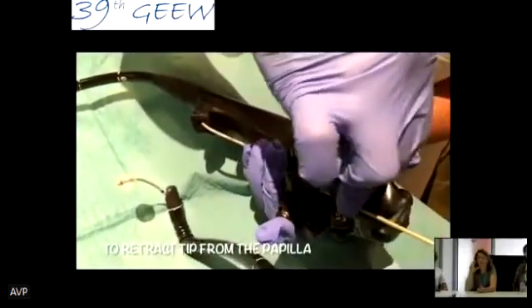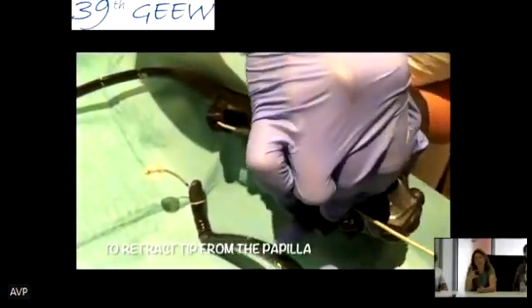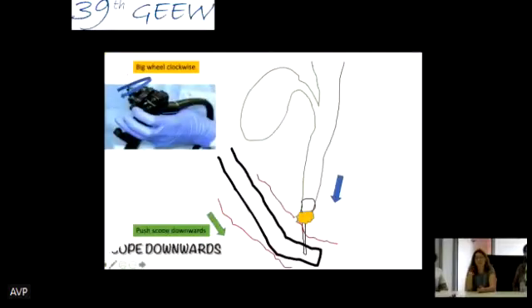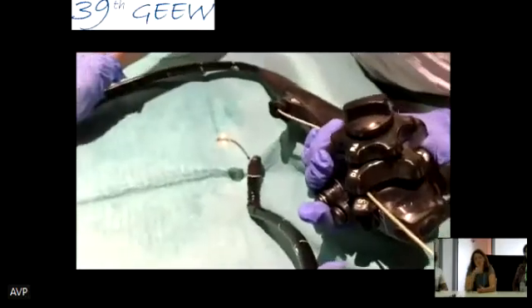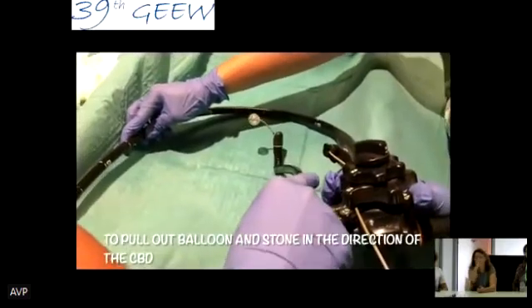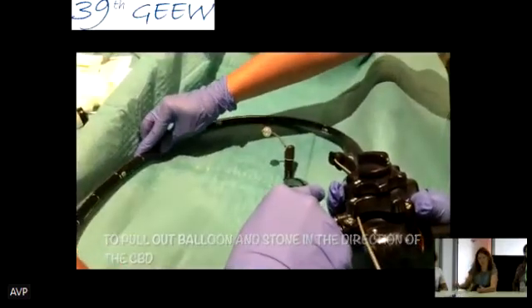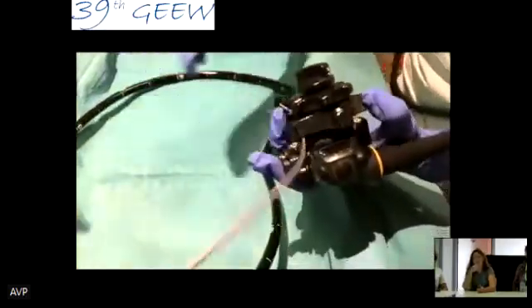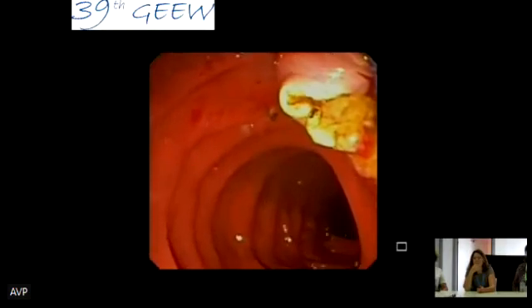So by retracting the tip from the papilla, big wheel up, and pushing the scope downwards and giving it a bit of clockwise torque to go in the direction of the bile duct and to bring the stone in the same axis. So this is the maneuver for the extraction.